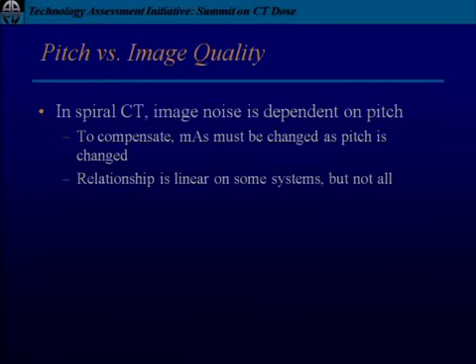The GE, you change the pitch, it knows the configuration difference, and you'll see the MA box turn orange because it changes that for you. And if you say, no, wait, that's not what I typed in, and override it, you will now get a change in noise just because you tried to change your pitch.